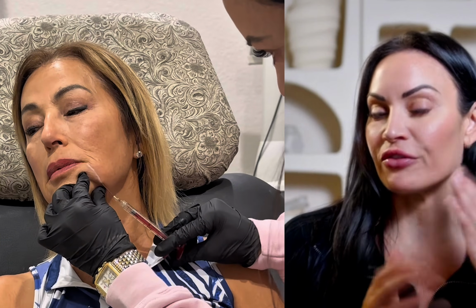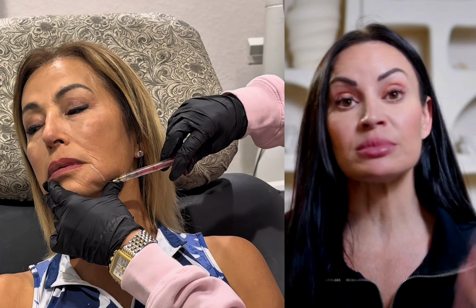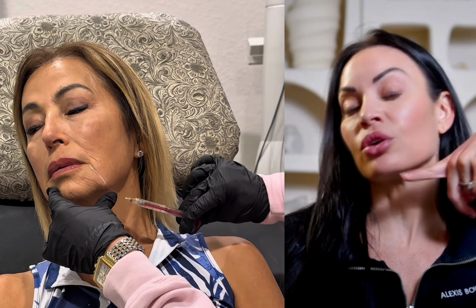And then I like to follow it up with a little bit of DAO tox if they need to, a little bit in the mentalis, and then a Nefertiti lift if they can benefit from it. But using small amount of product, honestly, typically with Form or with Versa, I'll use a 1.5 syringe and then it lays so beautifully. Sometimes if you have a little bit in that pre-jowl sulcus, I'll reorient the cannula using that same porthole and come downward across the mandible to the chin and then soften the appearance of that pre-jowl sulcus. So that way you have a smooth marionette line chin shadow region and then all of it looks cohesive from the chin to the jowl.